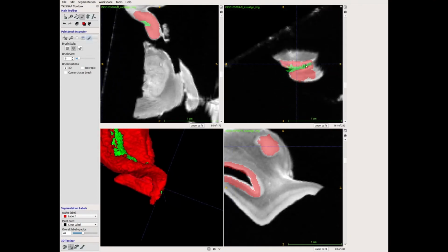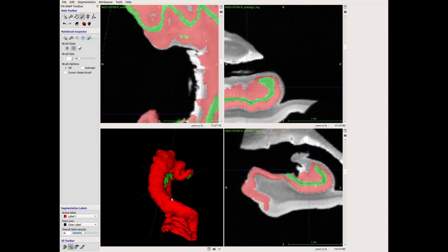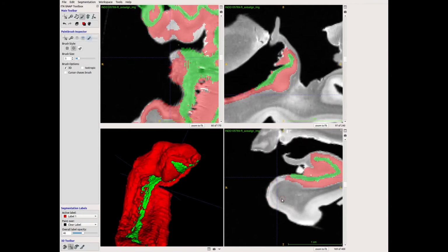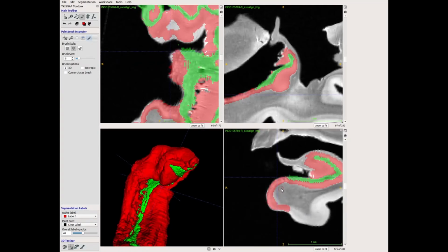Again, these are just the ways that I found are really time efficient to do this, and you can apply different strategies as long as you meet the conditions that are specified in the manual protocol that again was attached to our 2018 or 2019 NeuroImage paper.